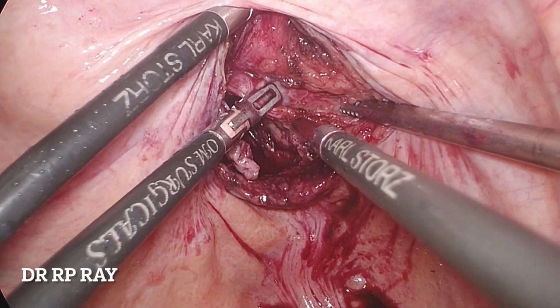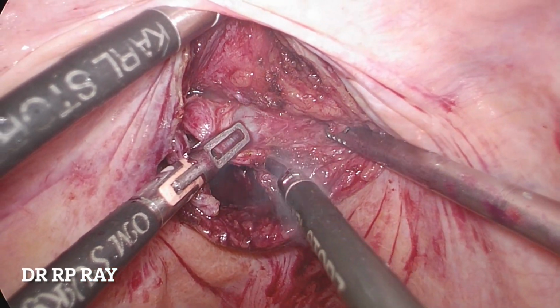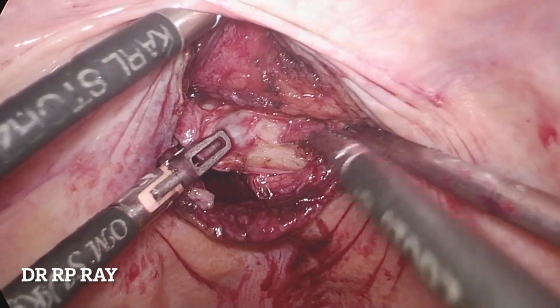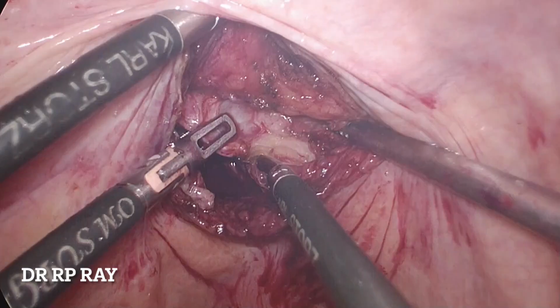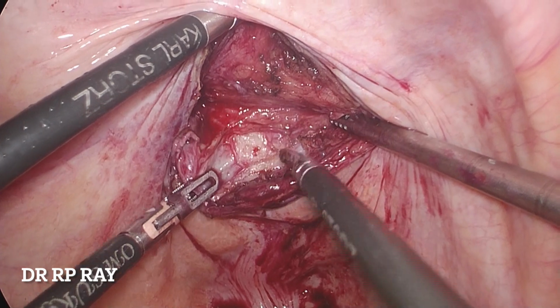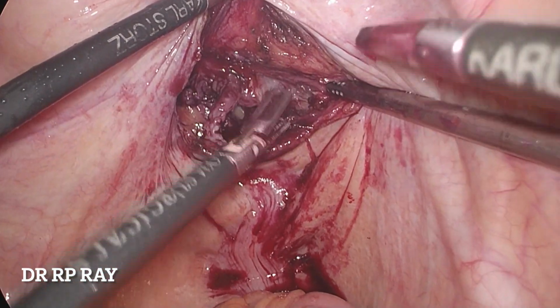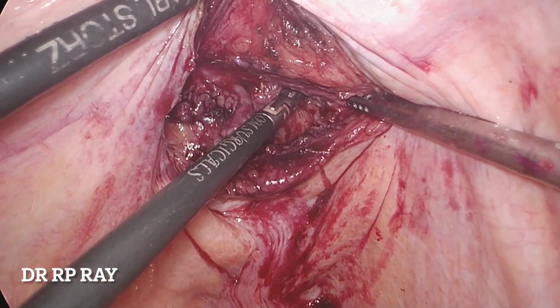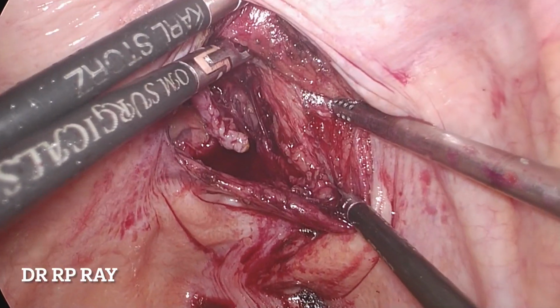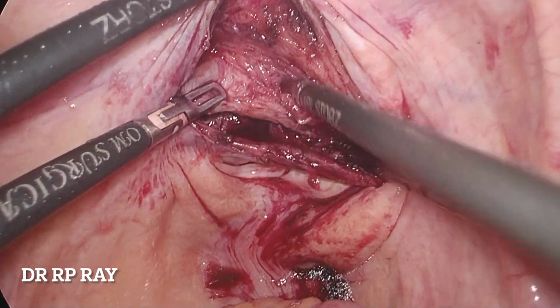The assistant's job is to give traction so that you can do the job easily, and you can see the surrounding structures are easily separated from the seminal vesicle. There are some small blood vessels supplying the seminal vesicles, which should be ligated with clip or by diathermy.